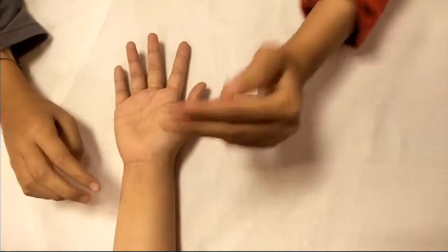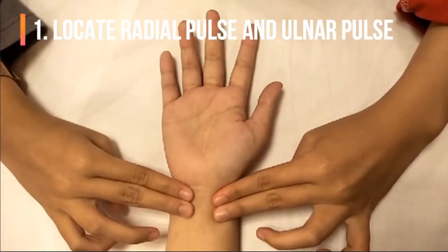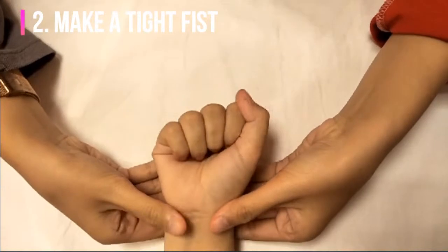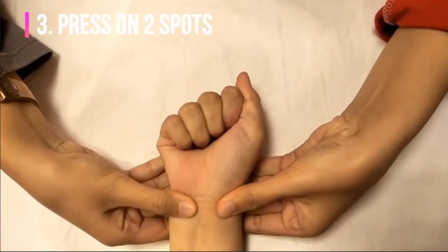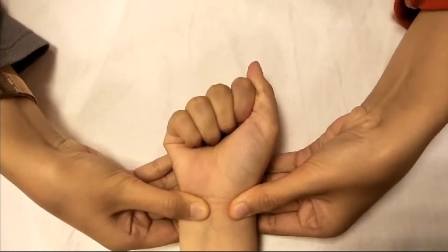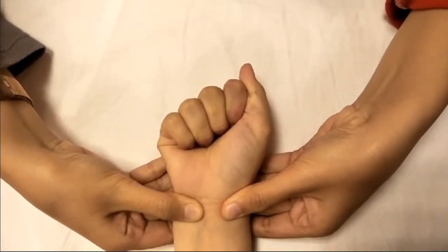First, locate the radial pulse and ulnar pulse on the wrist. Put one hand palm side up and make a tight fist. Press on two spots, radial pulse and ulnar pulse on wrist, to stop blood flow to the hand. One spot will stop blood flow through the radial artery and the other spot will stop blood flow through the ulnar artery.